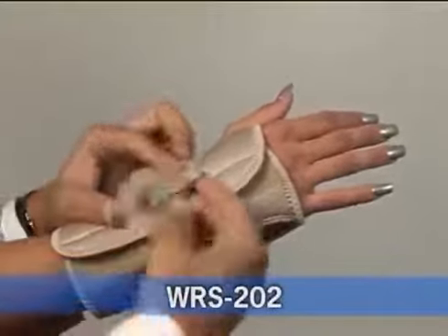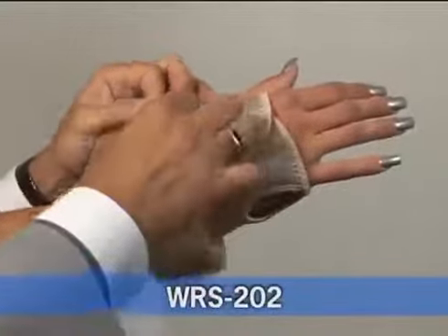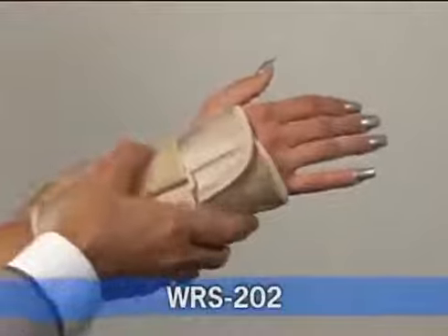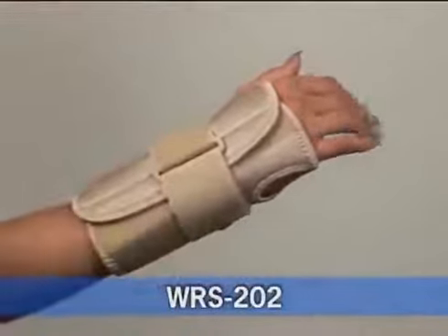WRS 202 is a universal neoprene wrist splint. It has a one palmar stay to help maintain the wrist in a neutral position. It's a breathable neoprene with terry cotton lining.